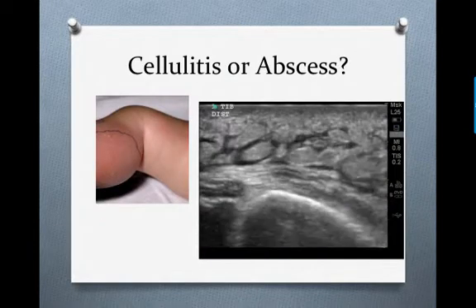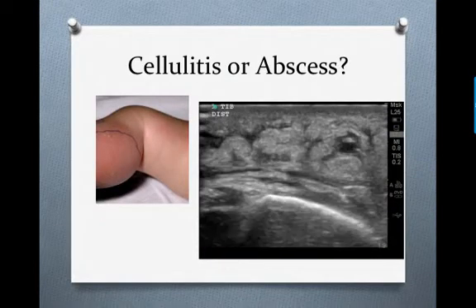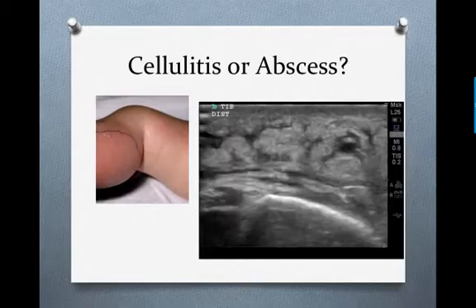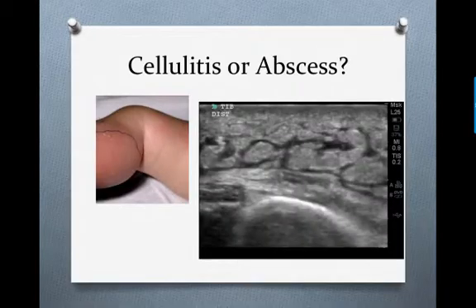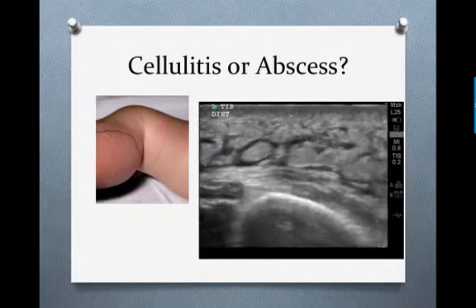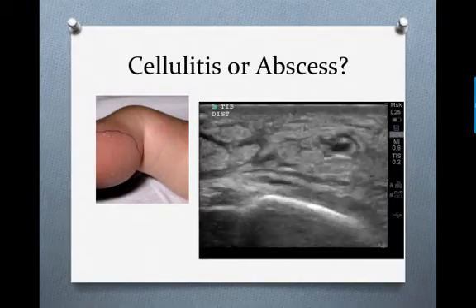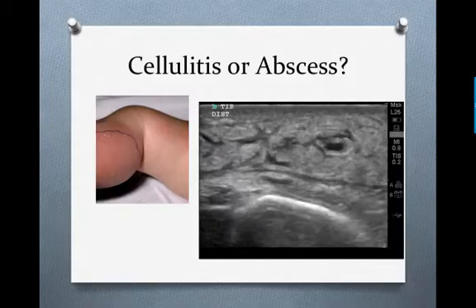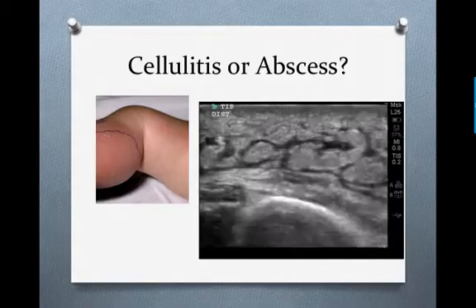Here's the ultrasound of our patient's leg. As you can see, there's no discrete fluid collection. Cobblestoning is present, so this is most consistent with cellulitis.